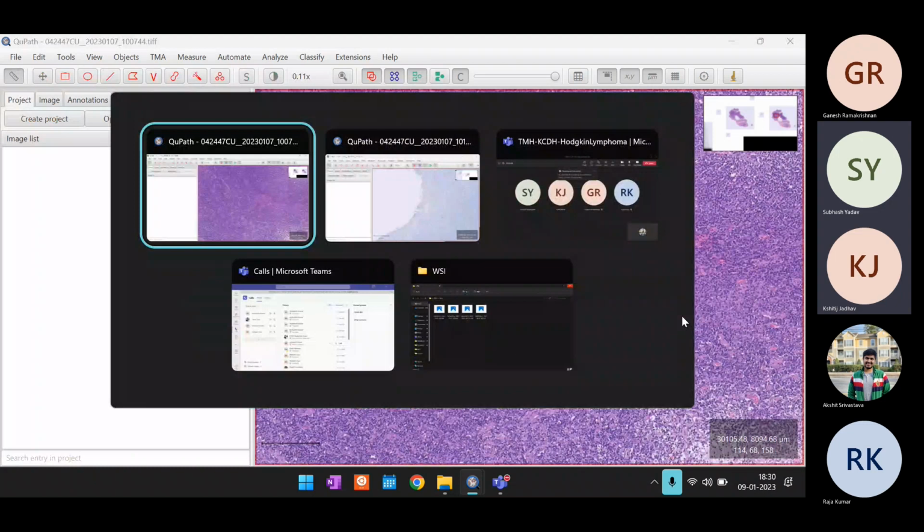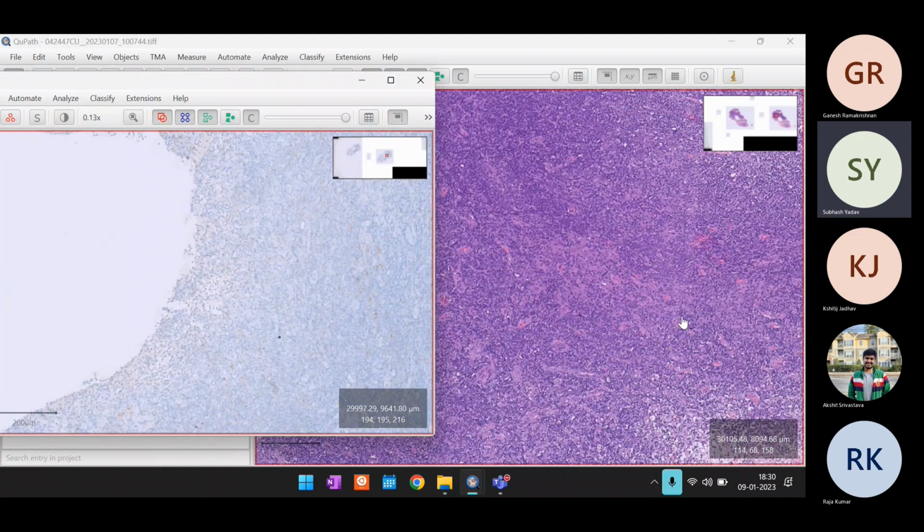Okay. Because in this I see a lot of RS cells, but we are going via the CD30 route because the CD30 is more specific, right? Yeah, it is more specific. So the HNE has its morphological characteristics, CD30 has its stain characteristics. That is the difference. But we are basically looking at CD30 stain characteristics because they are more specific and there is no noise from the other cells around.